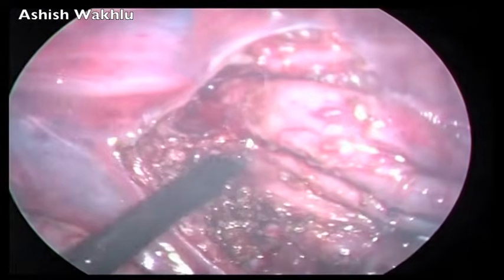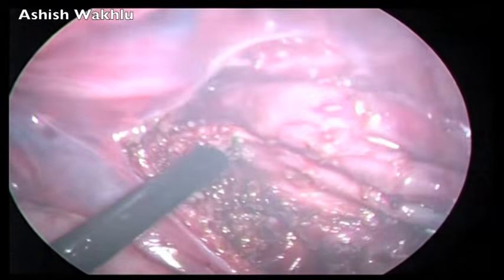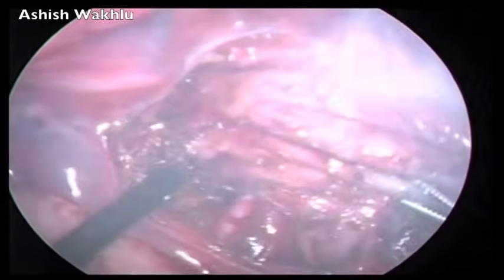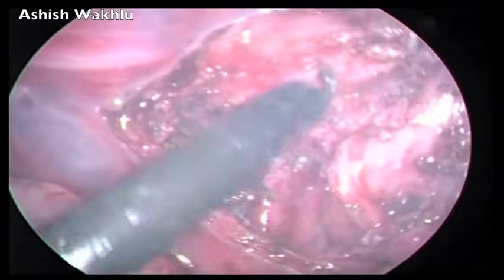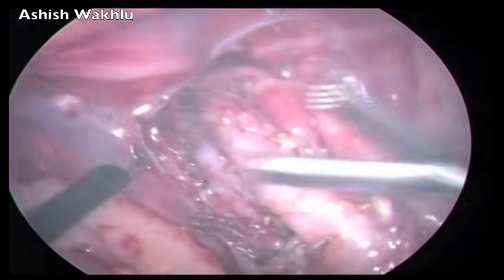So we continue to narrow the fistula down by dissecting the strands of it all around, always using the gap behind the rectum as a guide to get the proper plane.